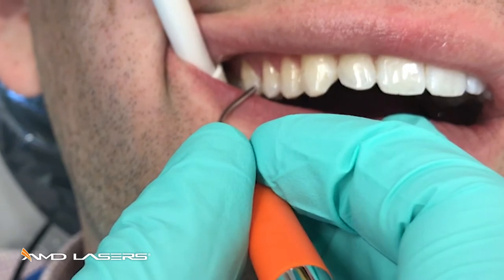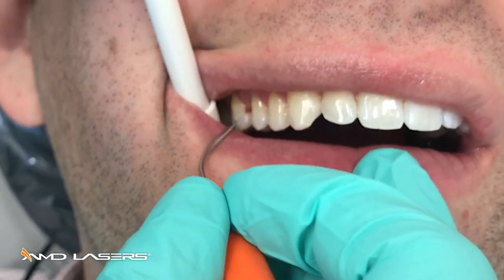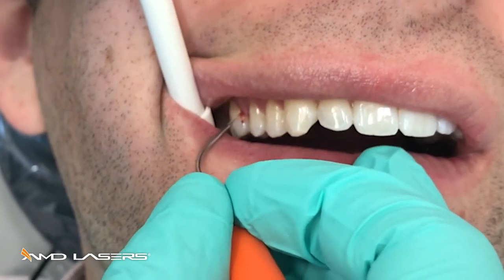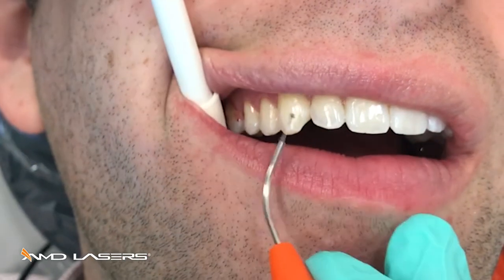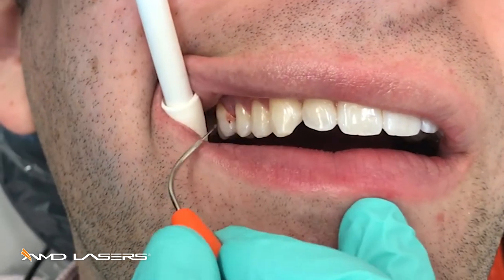I'm going to go back into the pocket, back up a little — about a millimeter — so I'm not dragging it to depth, gently against the tissue, and fire. The laser tip is just gently against the diseased pocket wall, and it's pulling out the granulated tissue, the diseased tissue in the pocket wall.